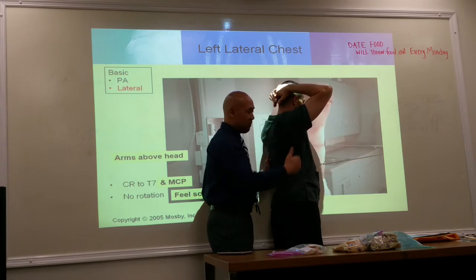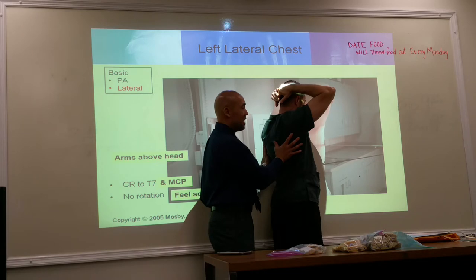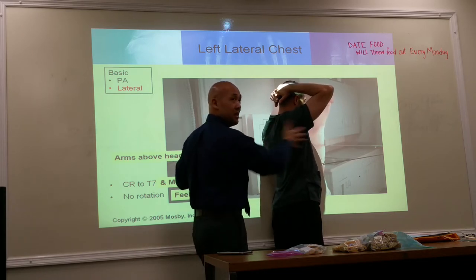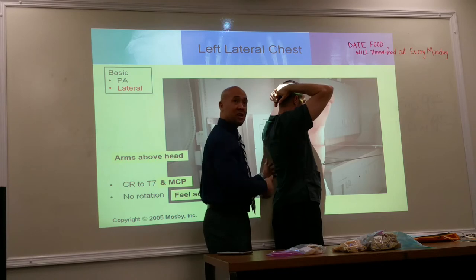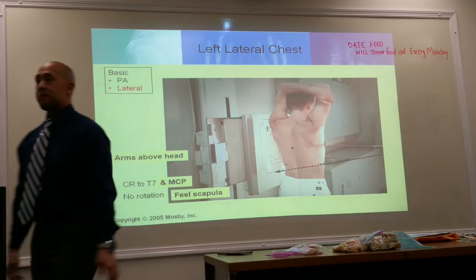We bring the image receptor down to make sure we're not cutting anything off from the beam's divergence this way. We rotate him slightly with his right shoulder forward because of the divergence of the beam going from side to side. I'm trying to mesh the divergence. Okay? All right, go ahead. Thank you. Okay?